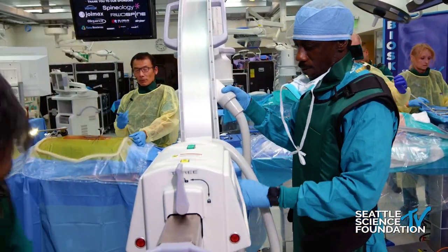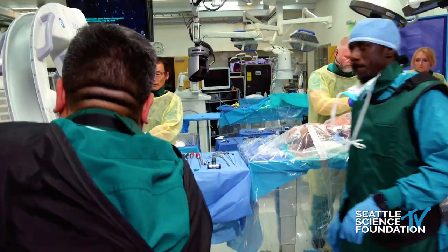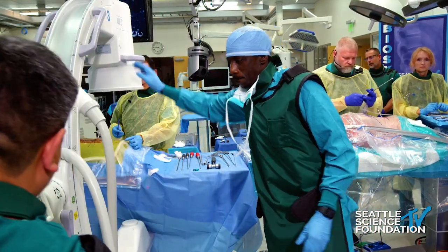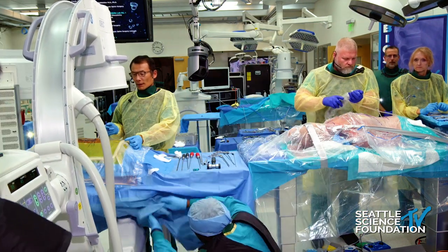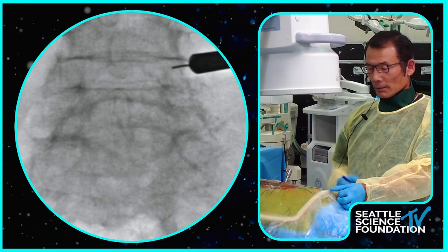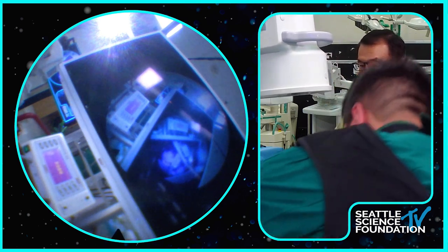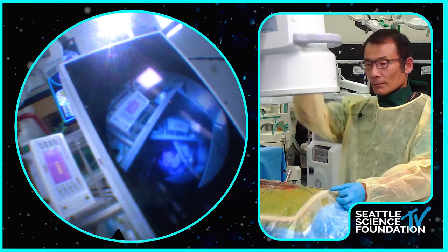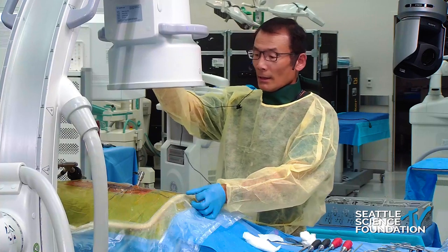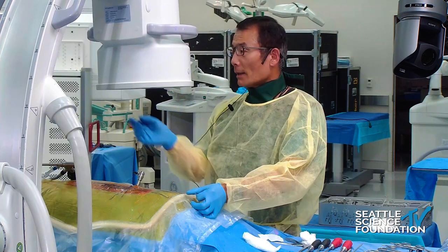As I said, medial-lateral wise, I use one of the screw holes, the caudal level screw hole, as my endoscopic entry point. So it's a matter of 4 incisions or 5 incisions. Push in. That's pretty good. All right. That's good. Thank you. Can you just take a peek?